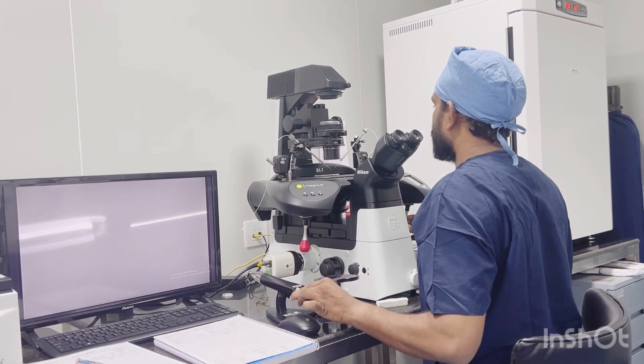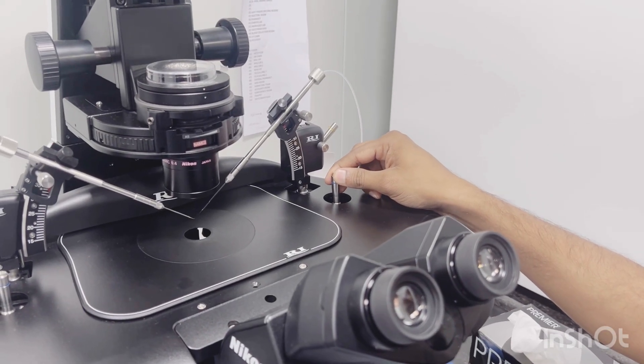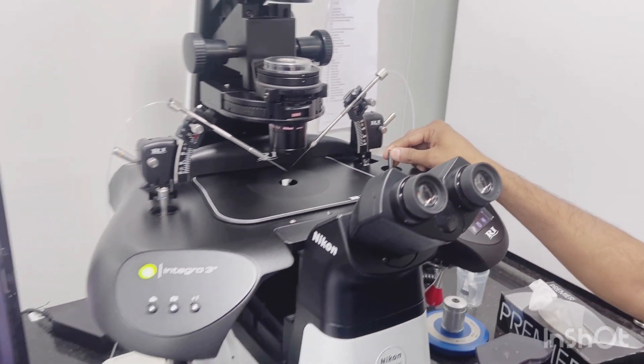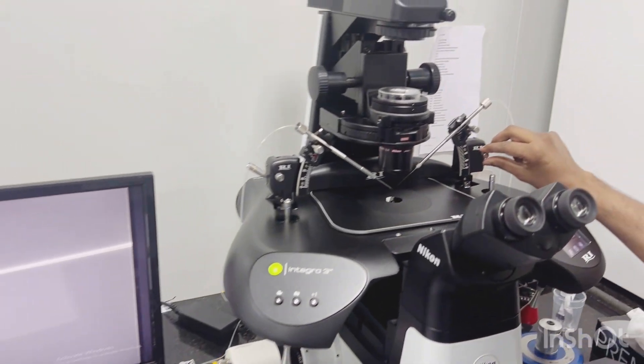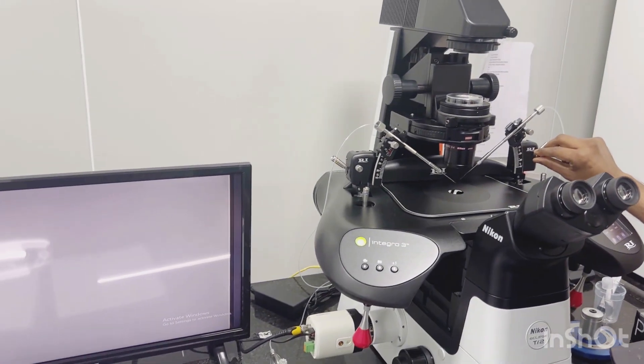By this way, we can align our injecting pipette. The use of this knob allows us to position the injecting and holding pipettes where we want. The second knob here is the centering knob - by using this, we can center our injecting and holding pipettes.